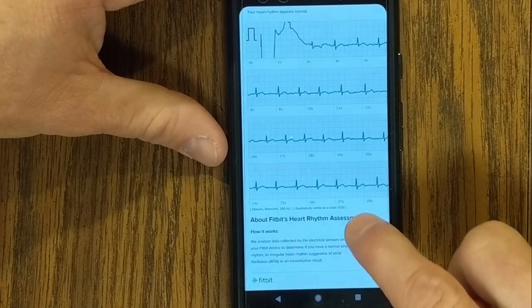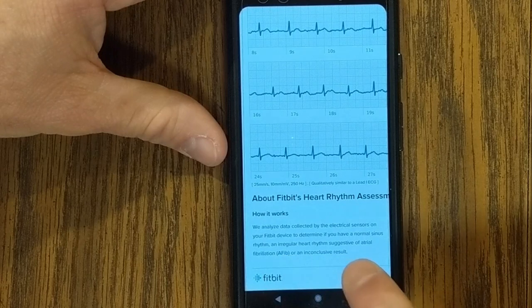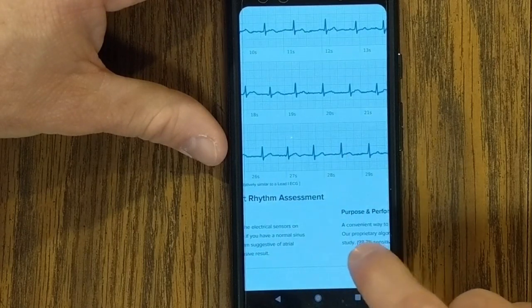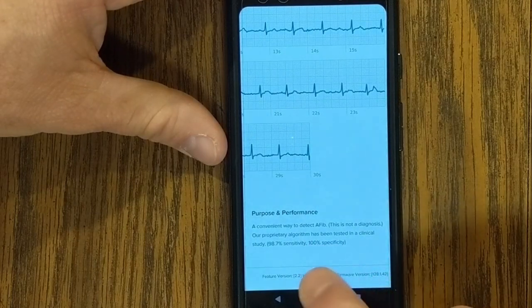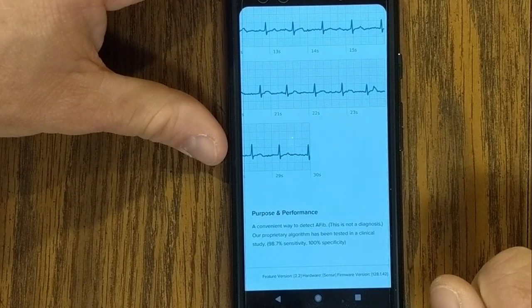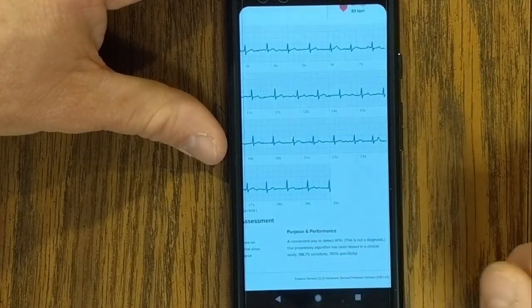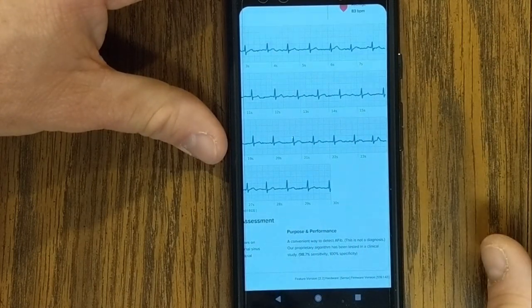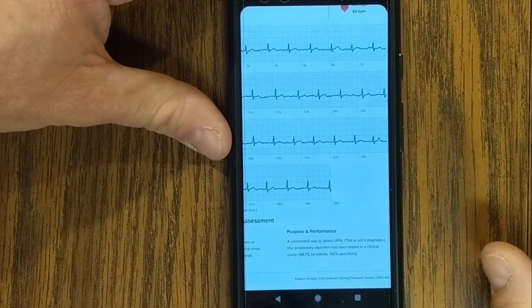At the bottom, it gives a little more information on how it works. 'We analyze data collected by the electrical sensors on your Fitbit device to determine if you have a normal sinus rhythm or an irregular heart rhythm.' Under purpose and performance, it says it's a convenient way to detect AFib, this is not a diagnosis, and their proprietary algorithm has been tested in a clinical study. That's the PDF that gets generated — you can share it, save it, download it, or even print it. So if you want to share that with your doctor or take that information somewhere else, you can do that.